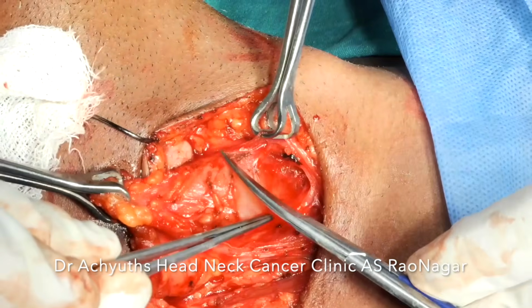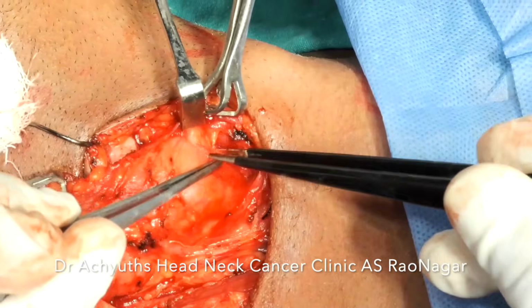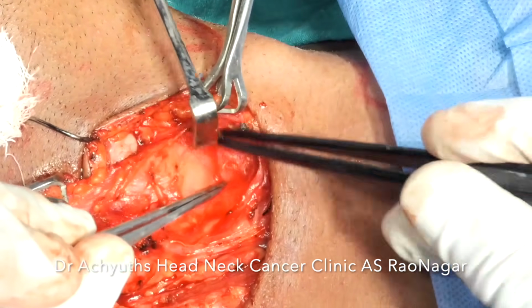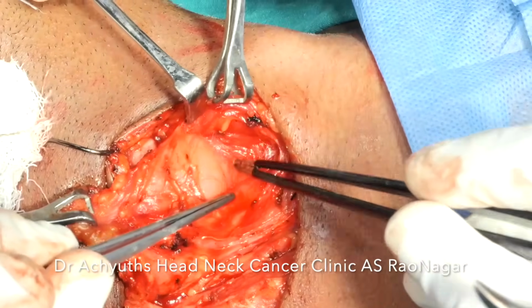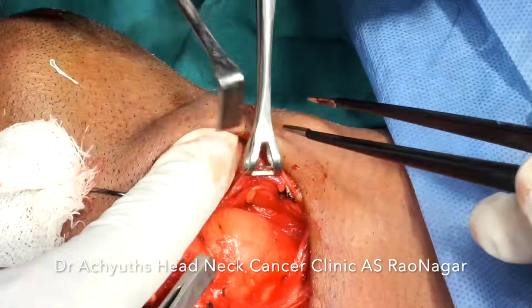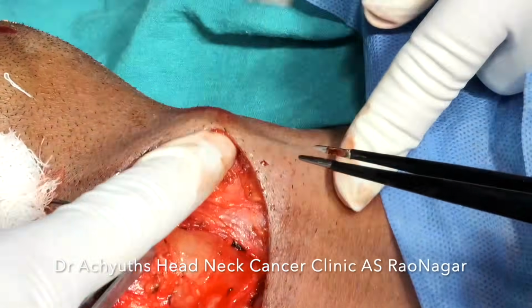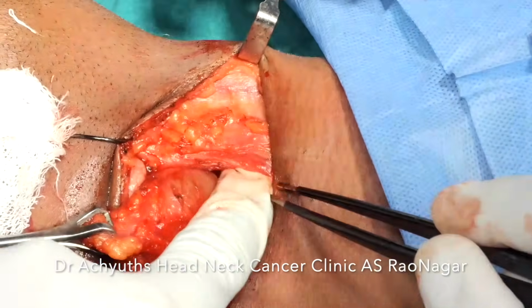So as you know, with the help of a Babcock's, we have held the strap muscles, and we are trying to do some kind of blunt dissection only. Cold swipes with the cautery. Now this is the laryngeal framework, the thyroid cartilage.